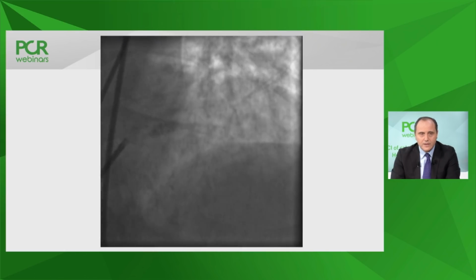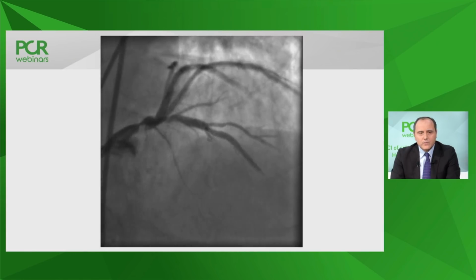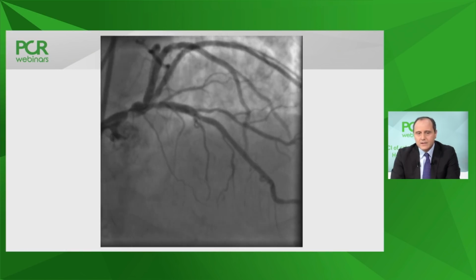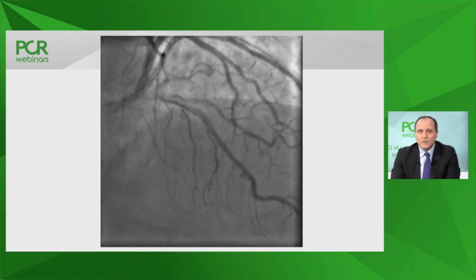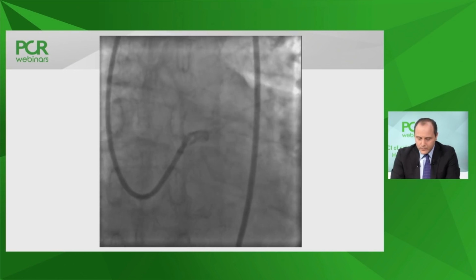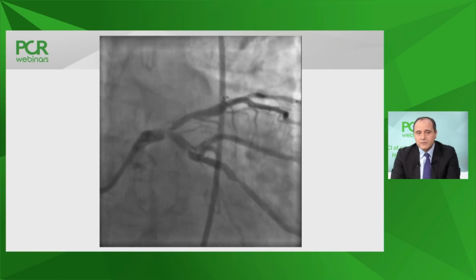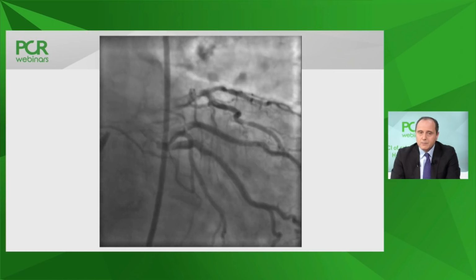Let's see another video clip. There we go. We see a cranial view here, very tight distal left main stenosis, and there is even a sluggish flow on this LAD. So I wonder how this patient managed to be relatively stable all the time. And here we have again the initial video clip where we have a summary of all the information we just shared.